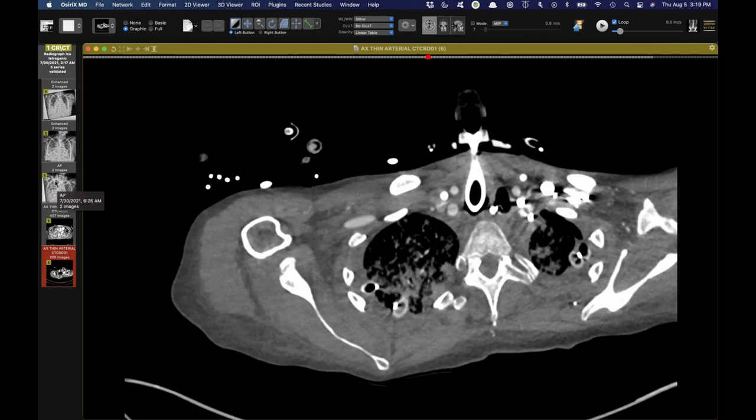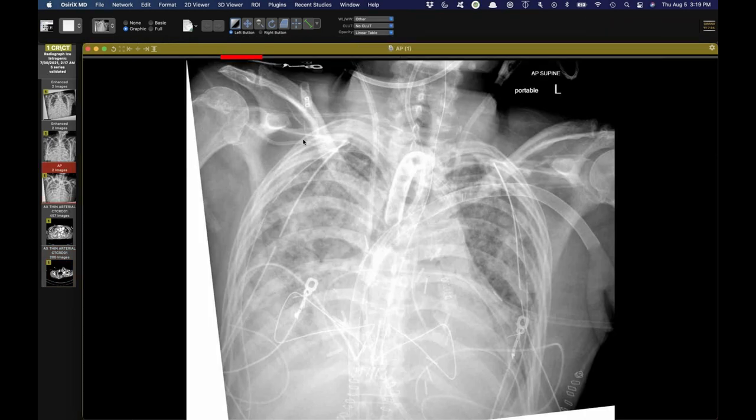And so just to go back to this again, this is why I preach to our residents and fellows, especially in daily ICUs, don't look at the lungs and don't just say lines and tubes stable. For me, at least, I have to enumerate everything, and this could be easily overlooked if you're not cognizant of it.